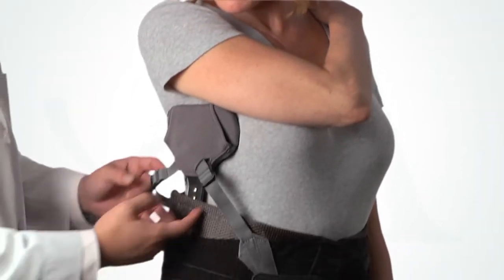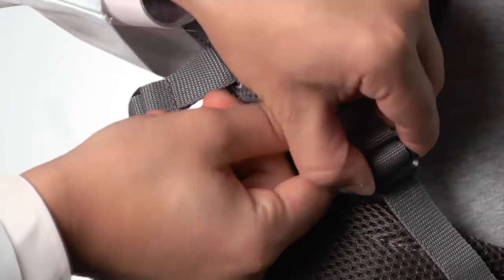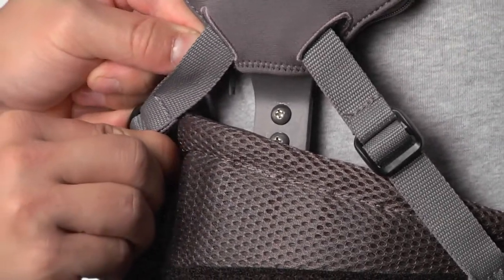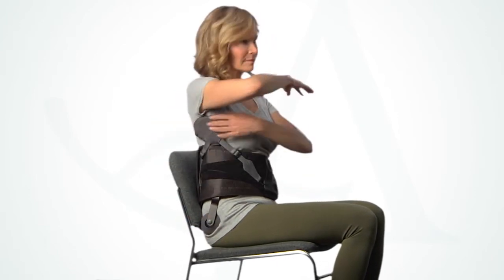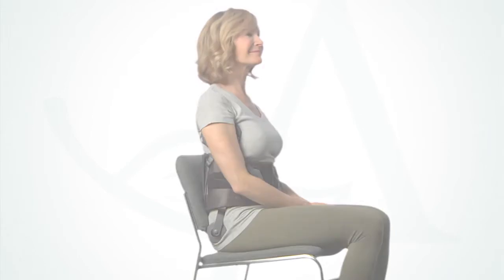Remove any slack by tightening the anterior and posterior tension straps. If additional force applied by the thoracic pad is required, either tighten the tension straps further or bend the thoracic strut. The final step is to confirm that the brace is comfortable while seated. Check that the trochanter pad is not too low and that the thoracic pad is not uncomfortably high.